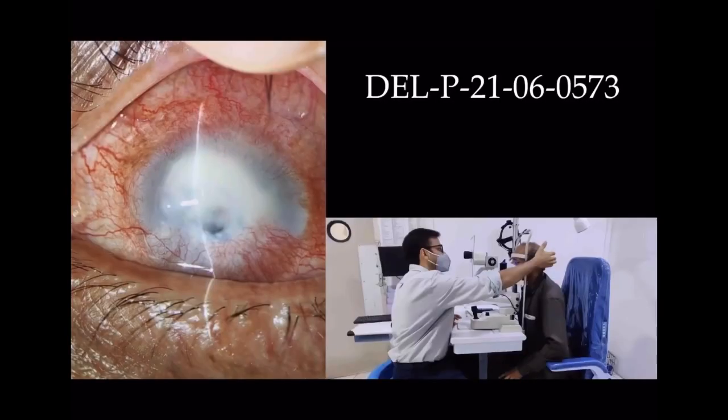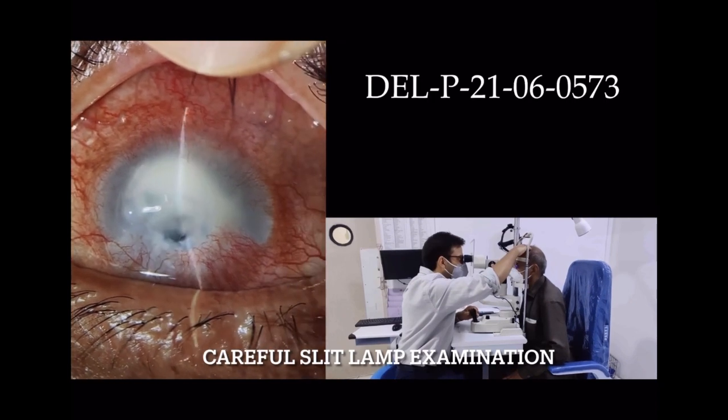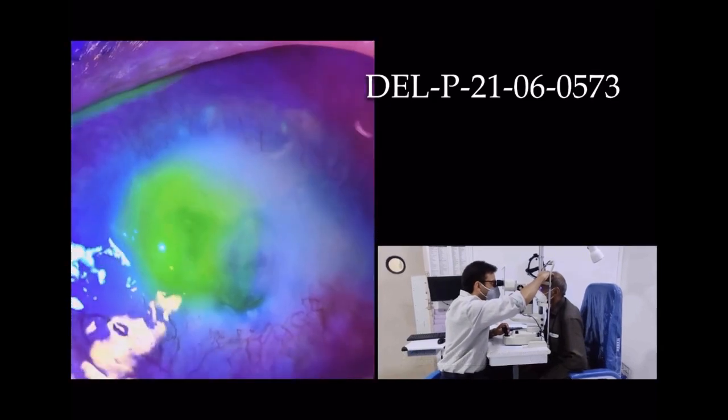In this video, we will be demonstrating the management of a case of keratitis with descemetocele using tissue adhesive with bandage contact lens. The first step is to perform careful slit lamp examination, which should be followed by slit lamp photographs and corneal drawings.